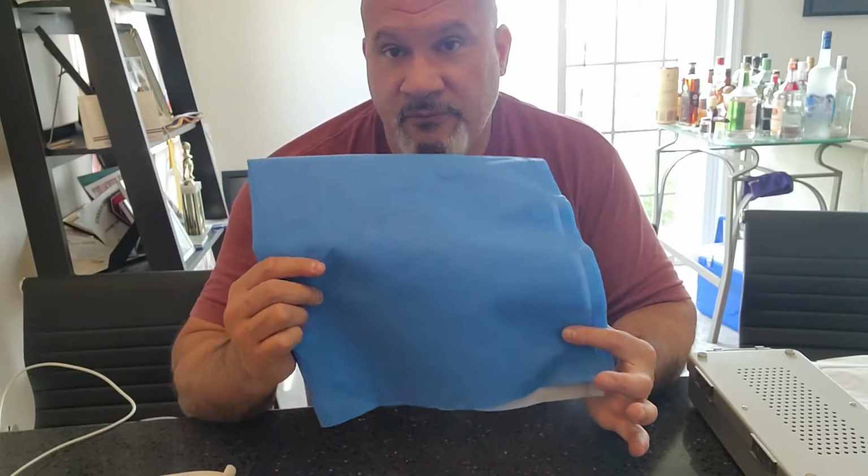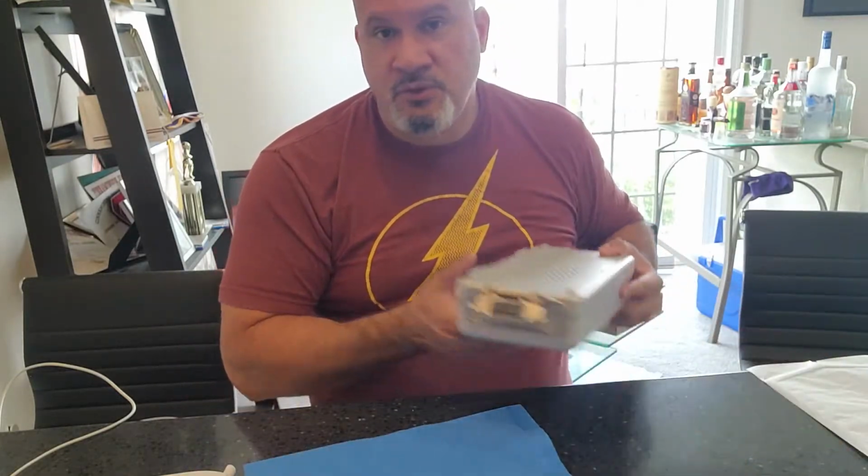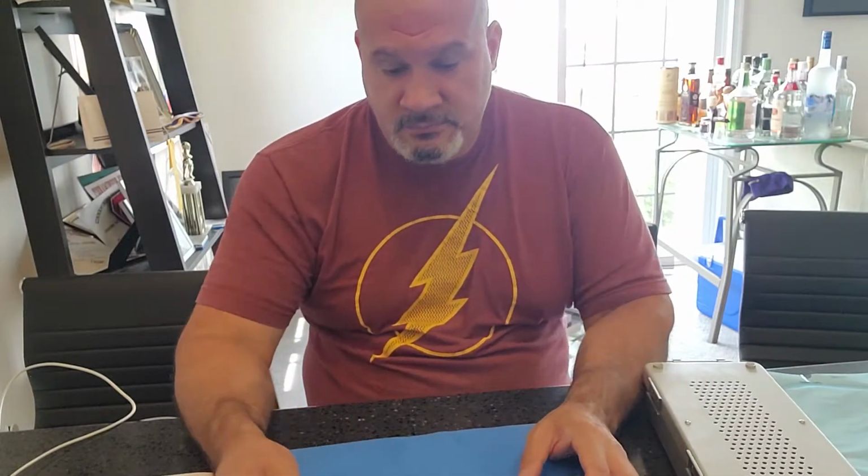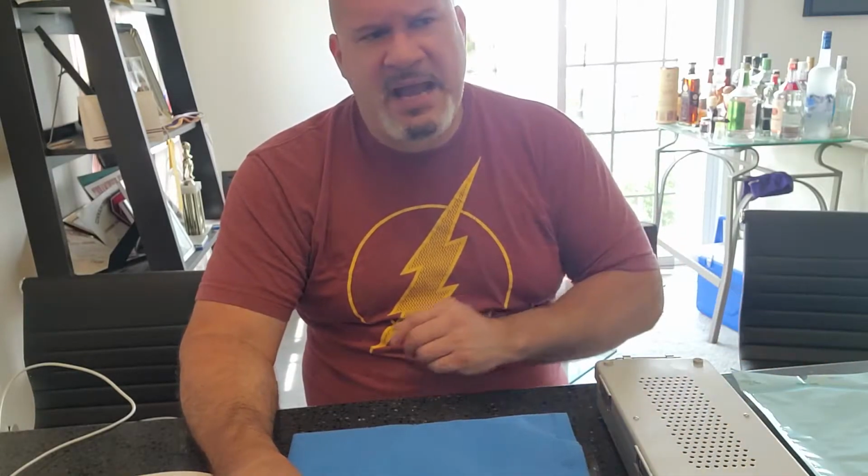Why did it throw me off? Because the only thing I knew we wrapped in the medical field and sterile processing is that we wrapped with sterilization wrap. You don't wrap with a container, and you don't wrap with a peel pack. So when I read the word wrap, this is what I thought. But I often saw them put it in rigid containers or in peel packs, and I used to question it and be like, nah, that's wrong.